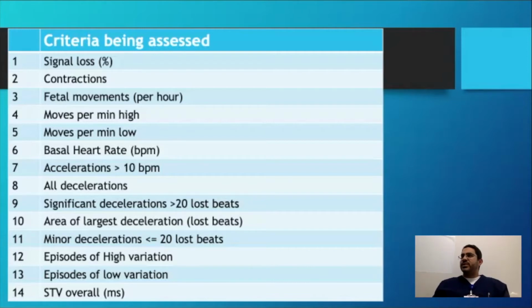Which one's the correct baseline? The one that we say. The one that you say, not the one that the machine has calculated. Someone says Dawes-Redmond is better than the human eye. No, that's very wrong. Dawes-Redmond is a test, and a test is as good as you use it.